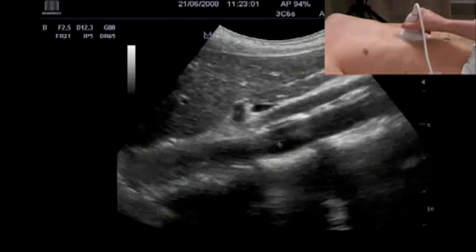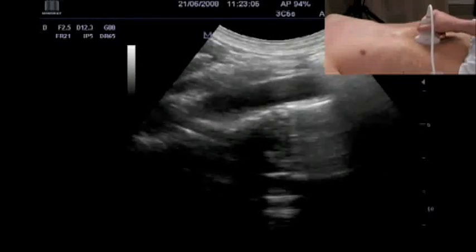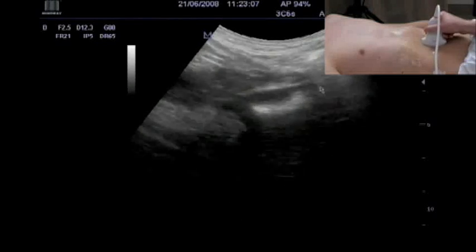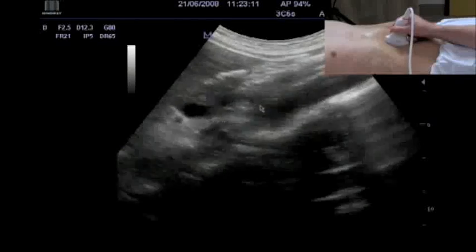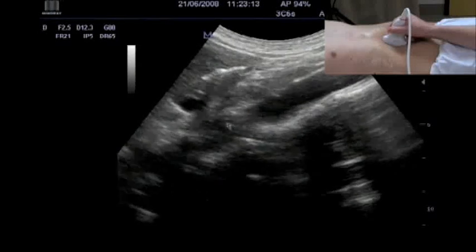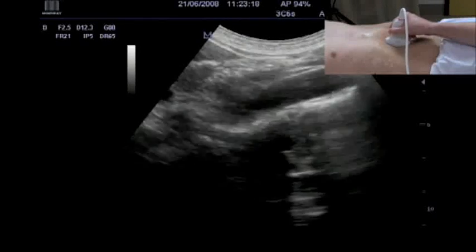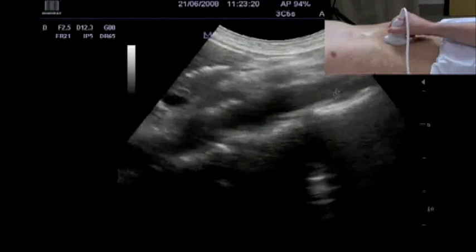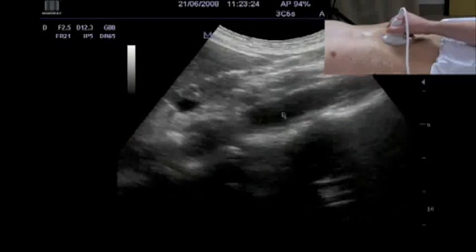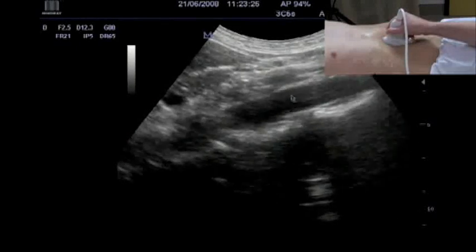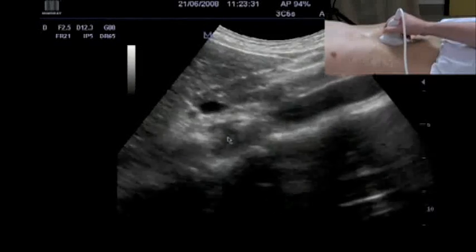Here we see the aorta and we can follow it. One should be aware that the normal diameter of the aorta is declining from cranially to caudally. If this is not the case, then an aneurysm of the aorta should be suspected. Here there is a normal decline of the anterior-posterior diameter of the aorta from cranially to caudally.